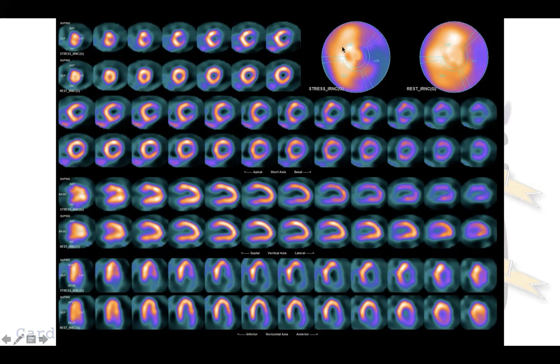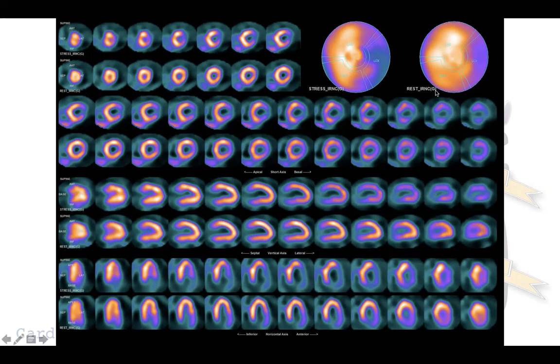It's very simple to read. For an easier first look, you can imagine your left ventricle like an umbrella. If you open the umbrella, you have a 2D representation — the bull's-eye — where in the middle there is the apex, and here you have the septal wall, anterior wall, lateral wall, and inferior wall, shown in the two conditions after stress and at rest.